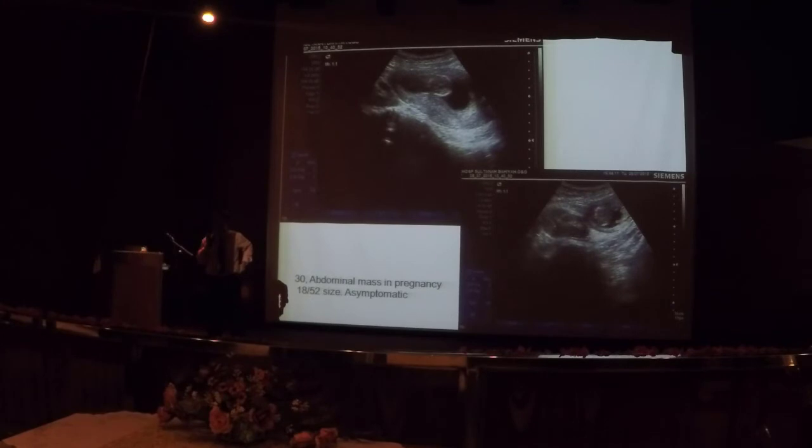Not opened bowels yet. Right? In the morning, they come for the scan, unable to hold, not opened bowels yet, so you can see stool. Commonly you see this kind of thing inside the rectum, giving a false appearance of a mass behind. So we ask them to open their bowels first, then scan. So do TVS, then it can give you a clearer picture. If still in doubt, send for MRI. So that will see clearer.